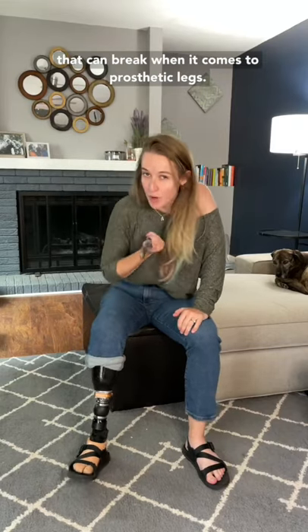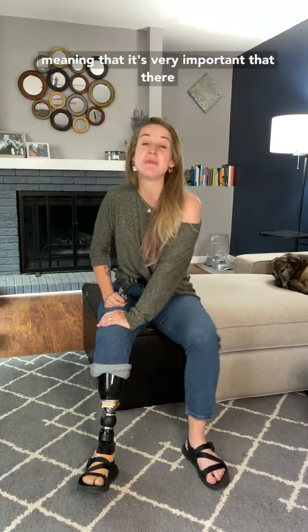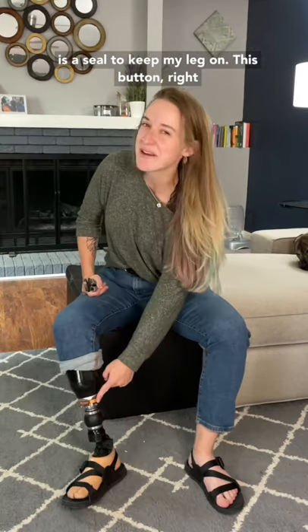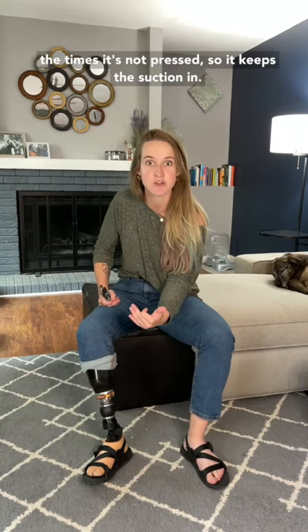There are a lot of different parts and pieces that can break when it comes to prosthetic legs, and one of mine has done just that on a long weekend. My leg in particular is held on by suction, meaning that it's very important that there is a seal to keep my leg on. This button right here is a big part in controlling that — when I press it, it lets the suction out, but most of the time it's not pressed so it keeps the suction in.